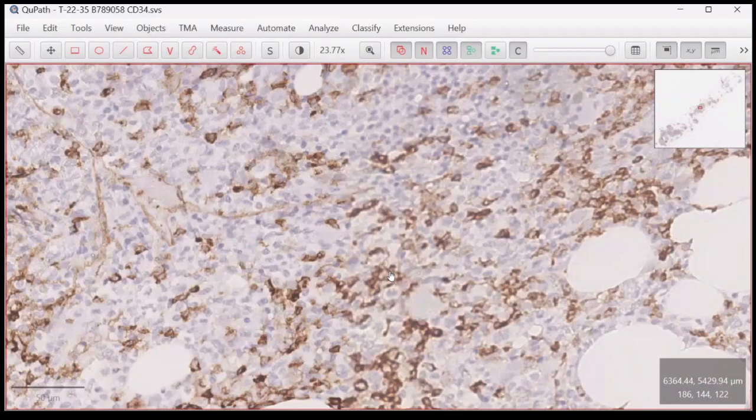If previously the patient was okay on treatment, and then suddenly on follow-up there are a few CD34 positive cells expressing CD34 in clusters, that pattern indicates early relapse or not in remission. What more? You have clusters plus numerous CD34 expression in the background. So this is a case of acute leukemia.